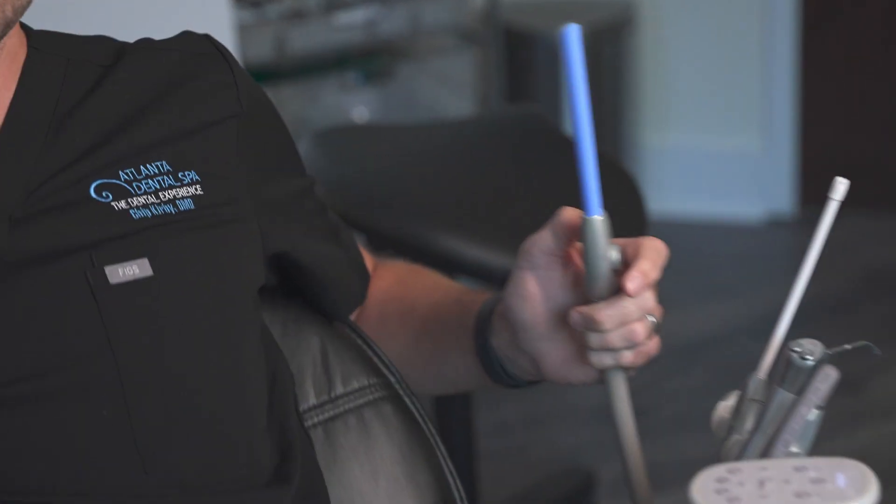So when you're a patient and you're in the chair, I'm sure you're looking around going, what is this stuff? So I'm here to explain it for you. So here we have our high vacs. This helps collect the saliva.